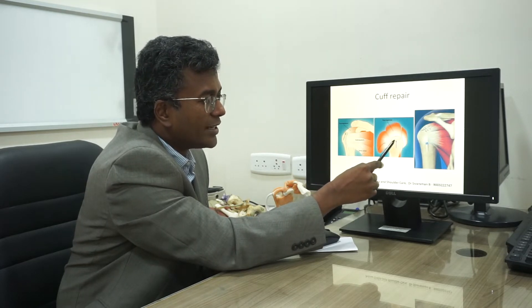If the cuff muscle is torn, we attach it back in place with the help of anchors and sutures. This procedure is called a cuff repair.